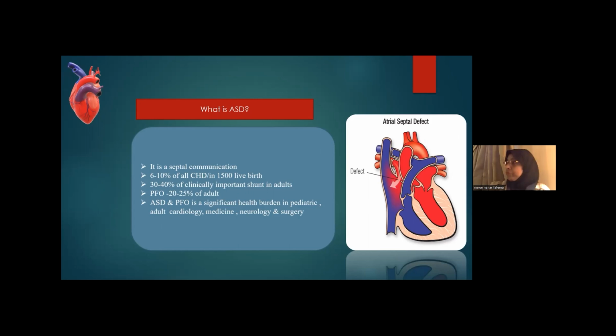Atrial septal defect and patent foramen ovale are a significant health burden in the pediatric, adult cardiology, medicine, neurology, and surgery population.